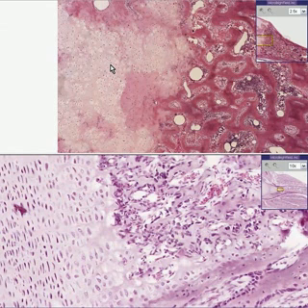You probably never will see a case of rickets in your life. Maybe you'll see some osteomalacia, but this is exactly what it looks like. Lack of normal cartilage to bone transformation due to lack of vitamin D, and I thank you very much.